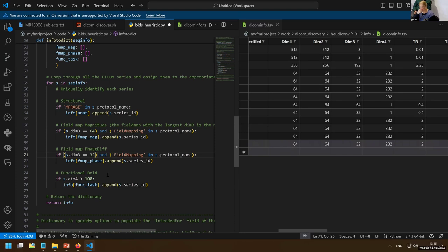Okay, yeah, sorry, I thought you meant solely that. Well, we've done a lot of this for CamCAN, and it's horrible. I guess in your case you disambiguate based on time stamps. Just pointing out that in the real world, it's not always a perfect DICOM directory for every subject. Also these protocol names, sometimes radiographers mistype something.